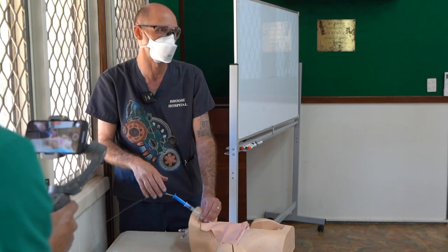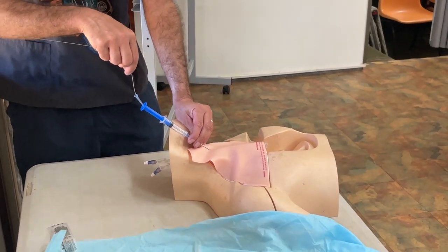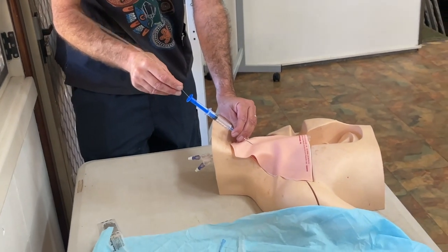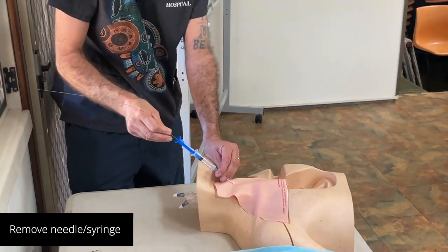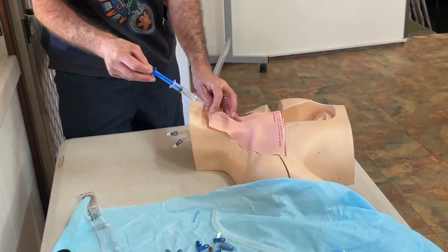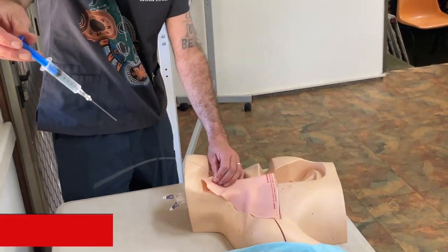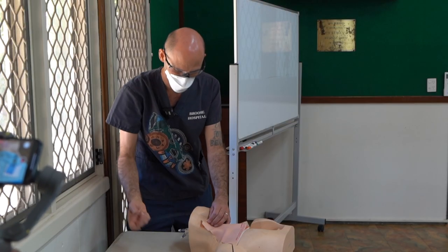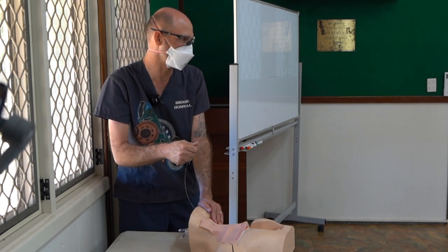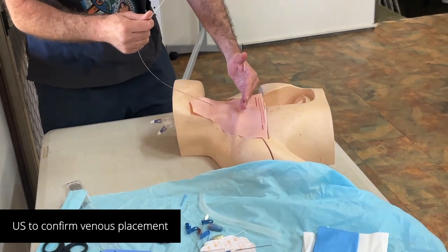If you do get an arrhythmia, it's okay — it just means you're probably a little bit far in. So stop. I've stopped at about three little marks on the wire, around 15 cm. I'm now going to pull my needle out. I hold my wire always — it won't get sucked in, but I might accidentally push or pull it. So I hold my wire as I pull my needle out and stabilize the mannequin. Now I can see my wire exiting the skin. The needle goes away safely to the sharps container. Now I've got a wire inside the vessel — but do I definitely know I'm inside the right place? I get the ultrasound and go down on the vein again to make sure I can see the wire inside in cross-section.